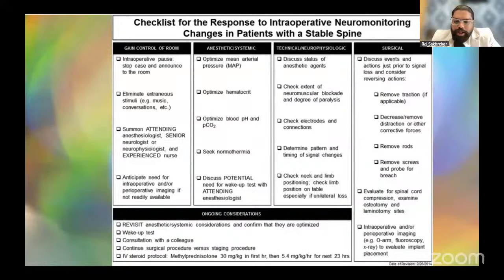That helps during the surgery, when the anesthetist or the surgeon gives the wake-up call and tells the patient to move your legs, and the patient understands and moves the legs. That's called the wake-up test. And that's very important from the intraoperative point of view, that the patient understands your suggestions and guidelines, and moves the legs in cohesion with the team.